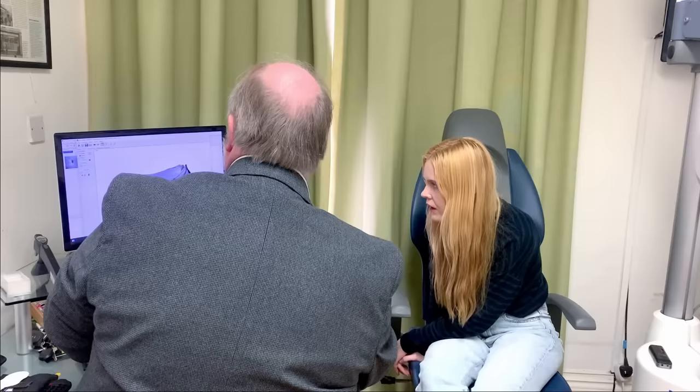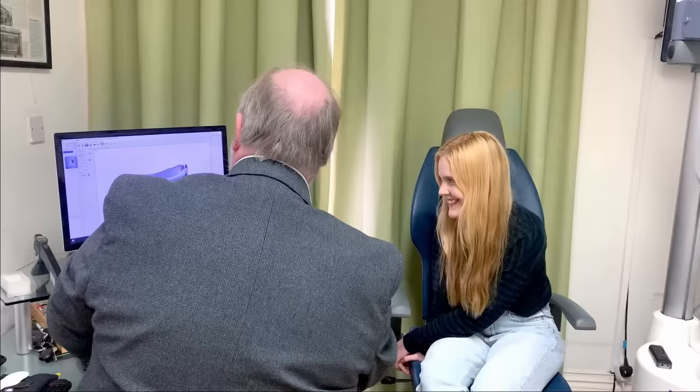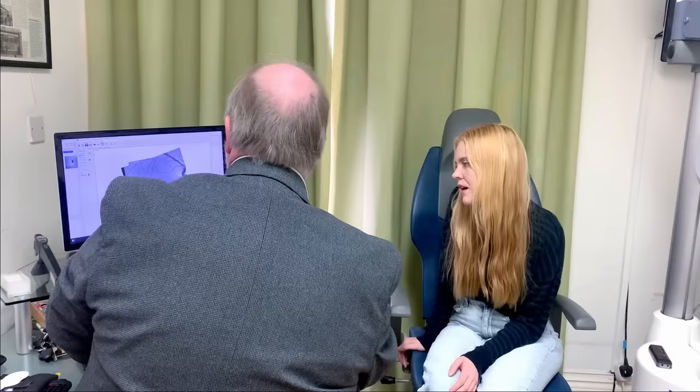And if I move this back, we can take little sections through your eyes, chop it up nicely. But thankfully, only with light. And you can see there's that little dip area. And then as we move back past it, it goes out of that area. You can see all the blood vessels point in towards that. The blood vessels don't pass across it, otherwise you get a dirty grey line across your vision.